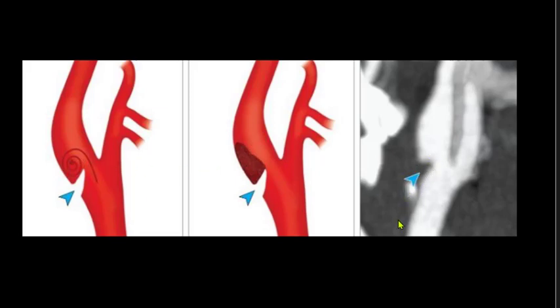Usually webs are very uncommon and we need to differentiate these webs from atheromatous plaques and dissection of intima. Intimal webs do not usually cause luminal narrowing. But the problem occurs when there is a disturbance in the flow pattern just ahead of the web, which leads to clot formation and strokes.